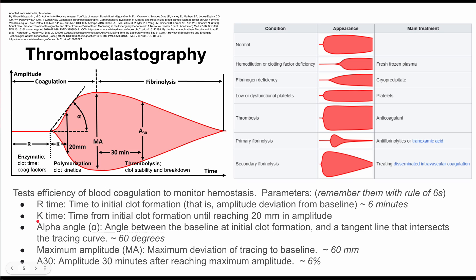The next parameter is the K time. This is the time from the initial clot formation to when you have about 20 millimeters in amplitude. That 20 millimeter mark is shown with this line here, and the time from the beginning of deviation to 20 millimeters is the K time. The K time represents the beginning of the polymerization phase, which involves clot kinetics.